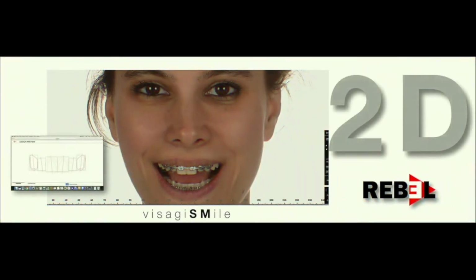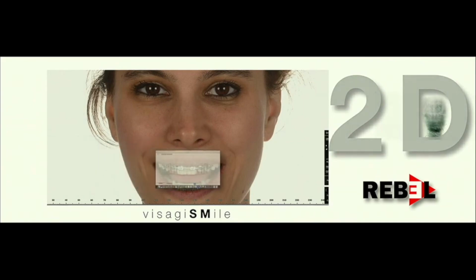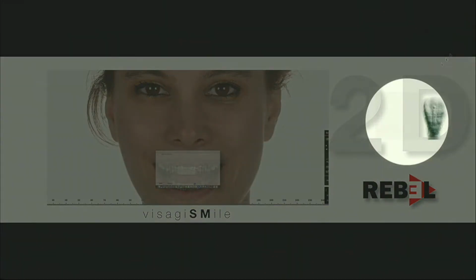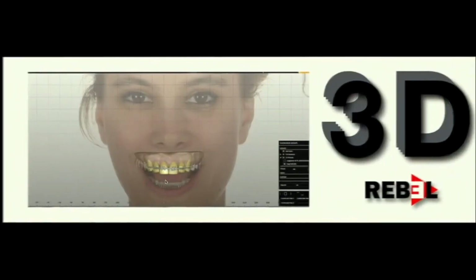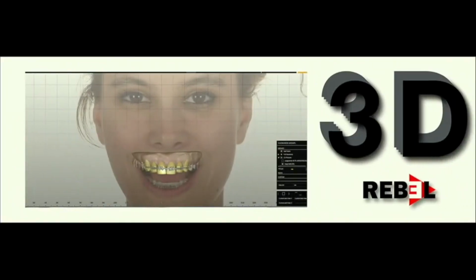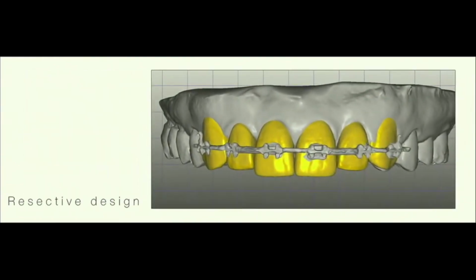So once Rebel receives this information, what happens is that immediately it gets this 2D design, overlaps it with the actual teeth of the patient, and as you can see here, it goes on with the morphing procedure on which tooth to be selected, and then converts it to 3D, and immediately we get a design that has been digitized in 3 dimensions to be sent to us.